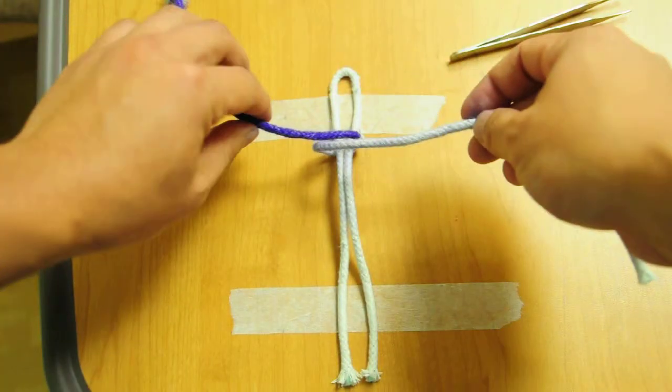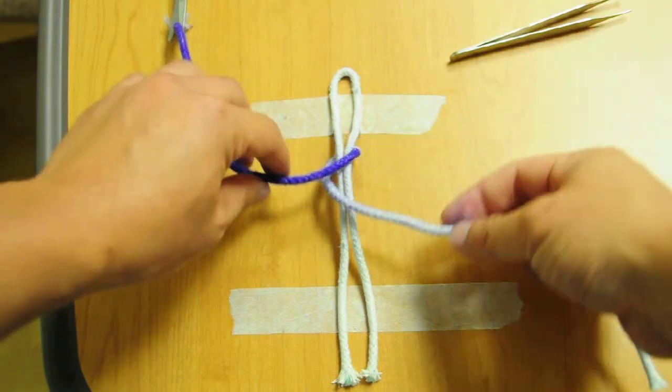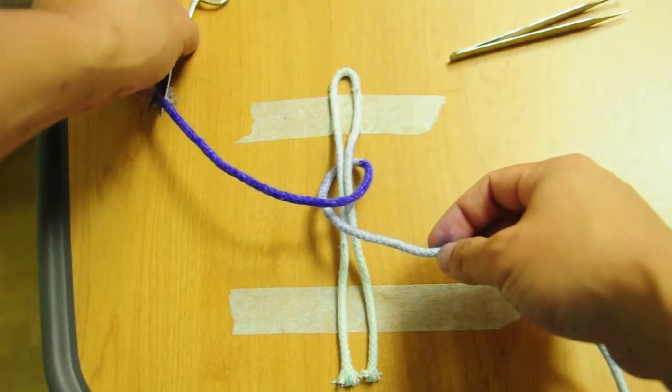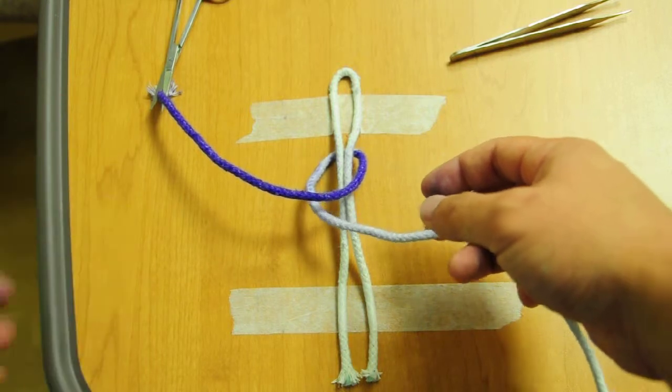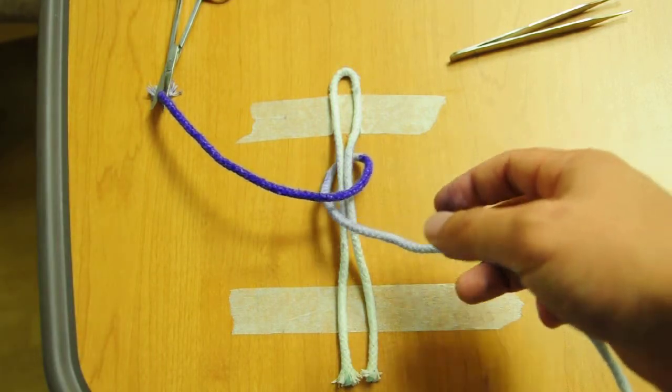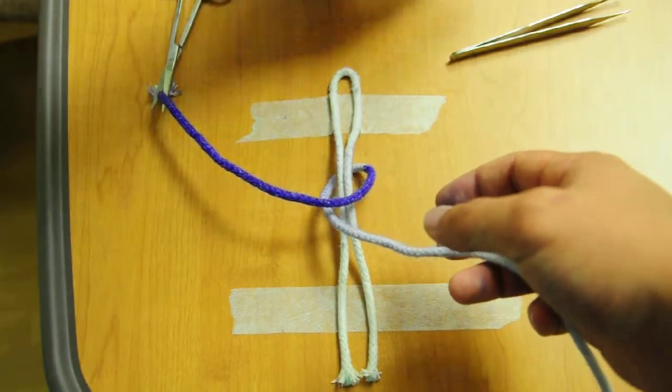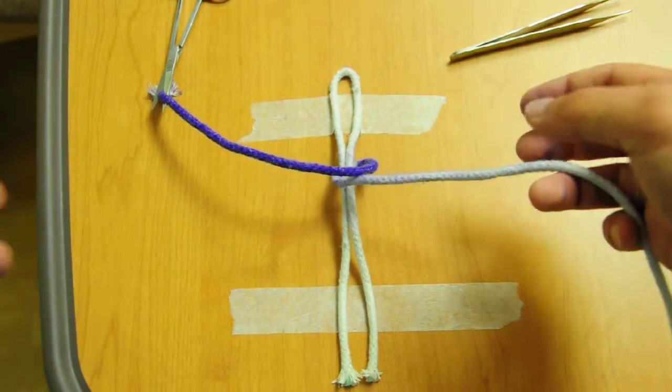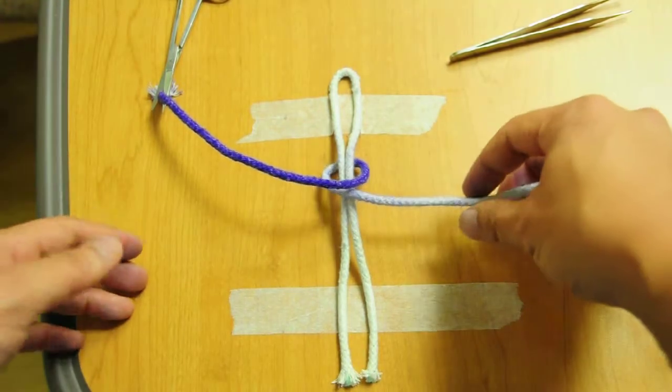Now, see the free end is in my right hand, so I'm unable to tie a left-handed one-handed tie, which is what I've been practicing the whole time in the call room. So now I have to make sure I know in this rare situation how to do a right-handed one-handed tie.